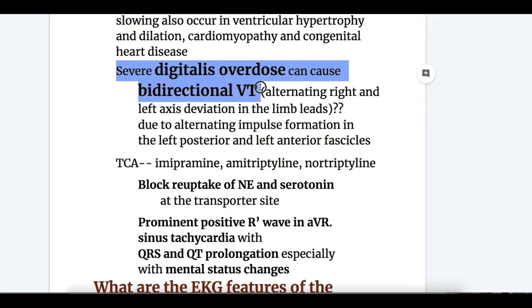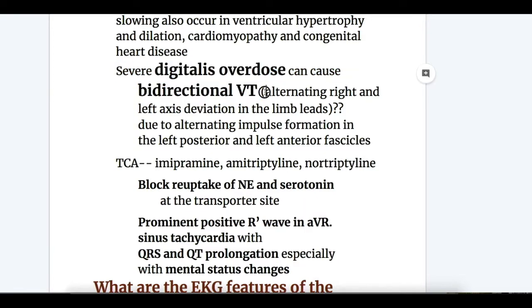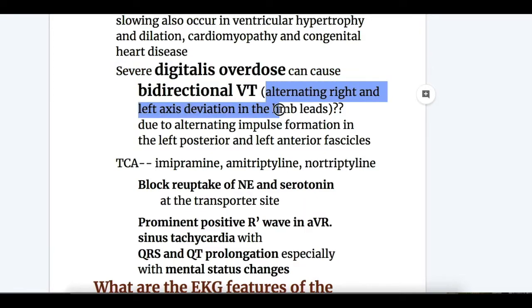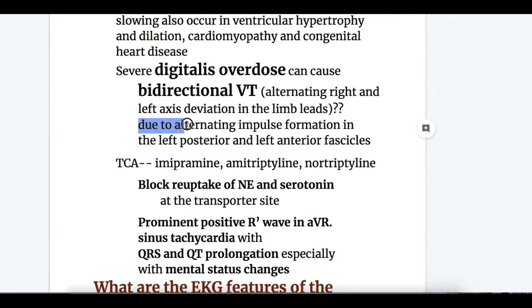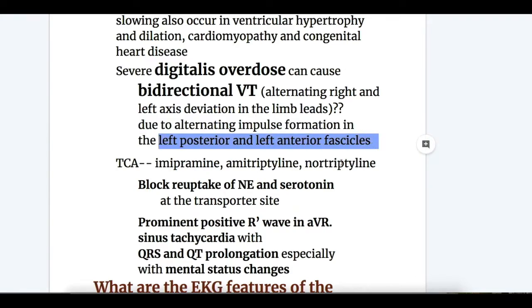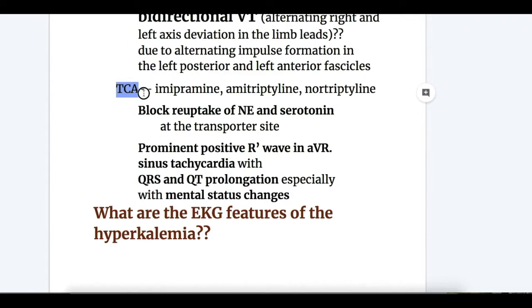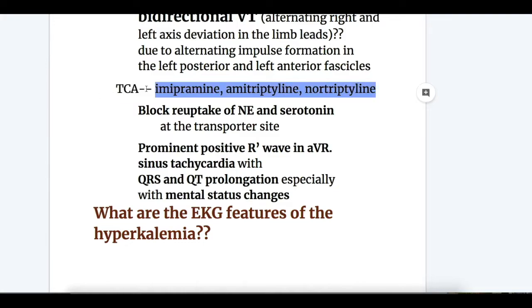Second, severe digitalis overdose causes bidirectional ventricular tachycardia — alternating right and left axis deviation in the limb leads. This is due to alternating impulse formation in the left posterior and left anterior fascicles.